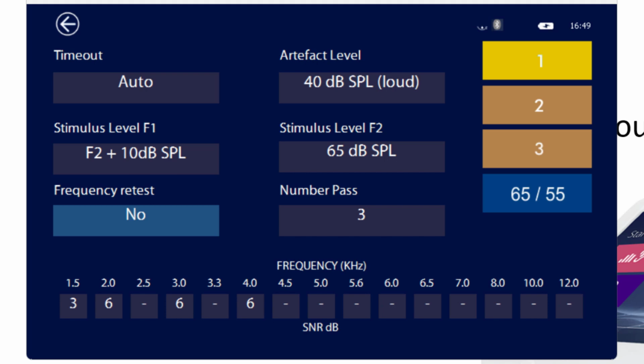Okay, I've been playing around, changing the settings back and forth. That made my number 1 turn yellow. If I choose the other one, go back, you see it now, it's green again. In case you didn't know, if you change something and you want to save it permanently, you hold the protocol number for a longer time until it turns green again. It means that it's saved permanently for now and in the future.